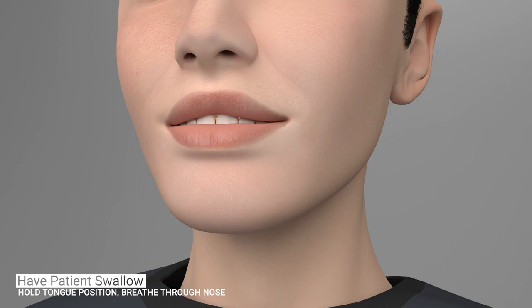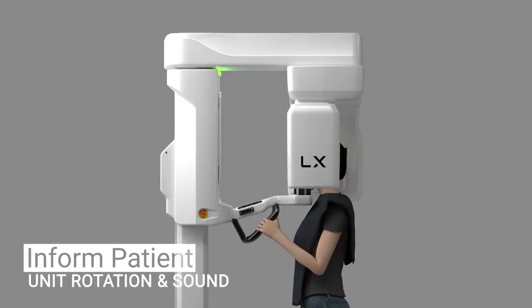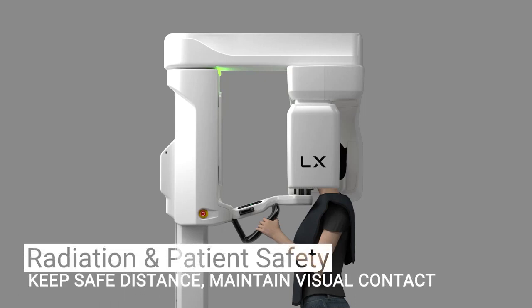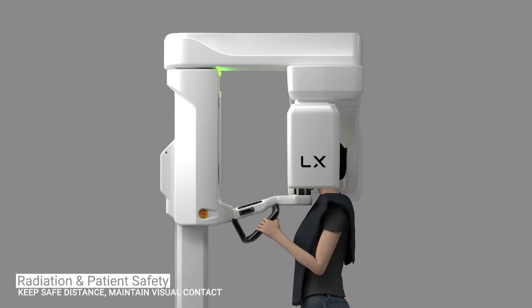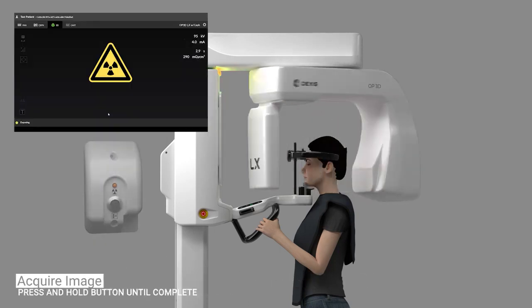duration of the exposure. Inform the patient the unit will rotate around their head and an audible sound will occur. Protect yourself from radiation in accordance with local safety guidelines and regulations while also maintaining visual contact with the patient during exposure. Press and hold down the exposure button until the process completes.